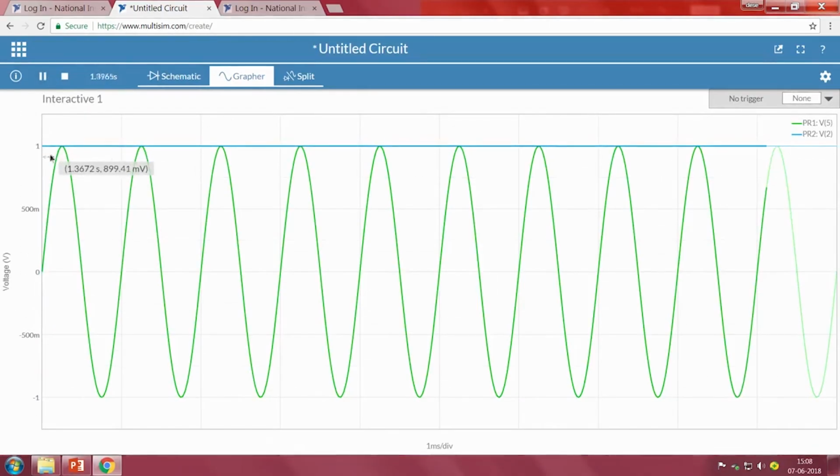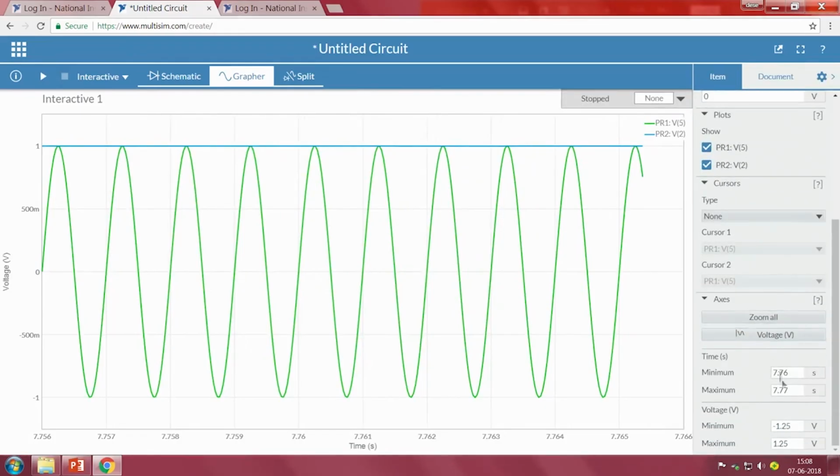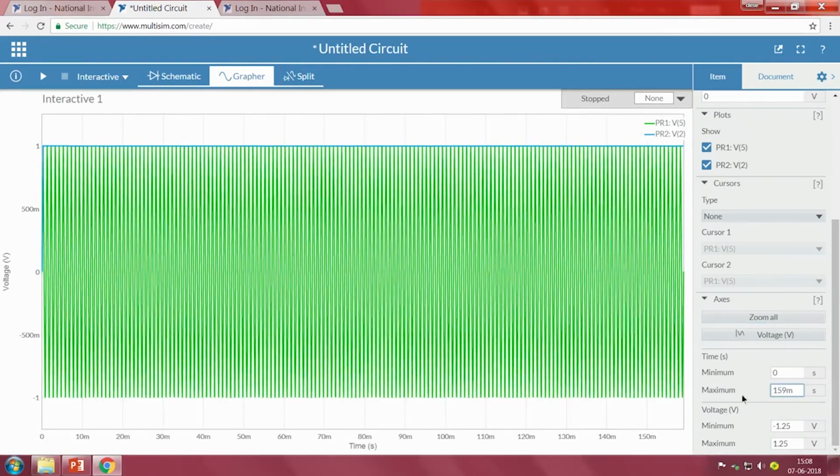See what we can see, the green is completely input, the blue is output, and the output is always showing as 1. Let me stop it. So, if it is showing the 1, how do we understand it? Now, if I zoom completely, zoom all, and let me zoom only to this particular portion somewhere around 159 milliseconds, and even to 10 milliseconds I will zoom.